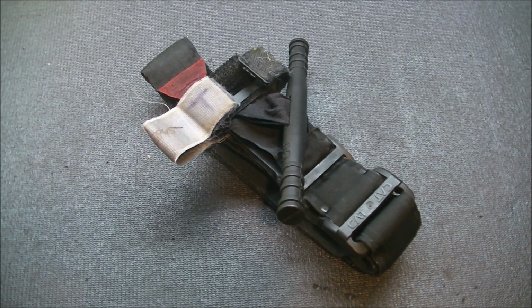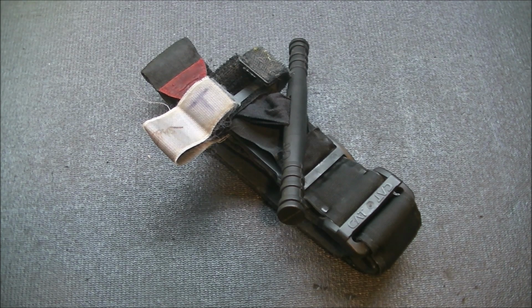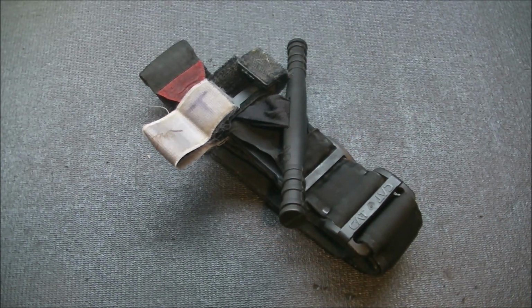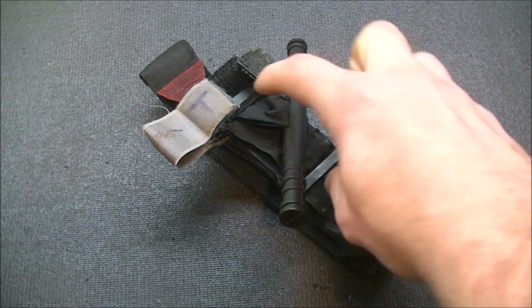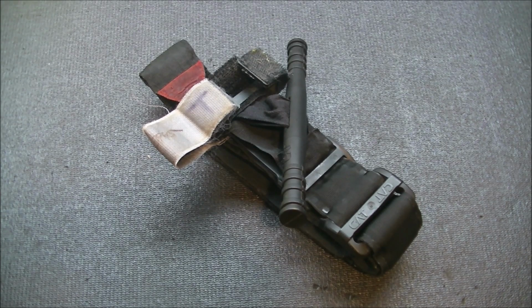So, does that mean it's the perfect tourniquet? Nope, because we do have some cons. Number one, there are a lot of copies of the CAT tourniquet. Not good copies. These are knockoff copies because this is a patented item. So you'll see a lot of these if you type in tourniquet on Amazon. You will get a lot that look like this, but the windlass is thinner. In fact, there was a medic in Ukraine who was trying to use one of these knockoff tourniquets. His technique was terrible. He wasn't even using the tourniquet properly, and he ended up breaking the windlass.